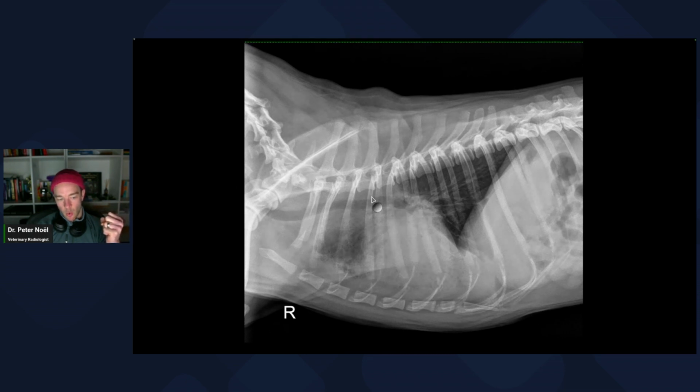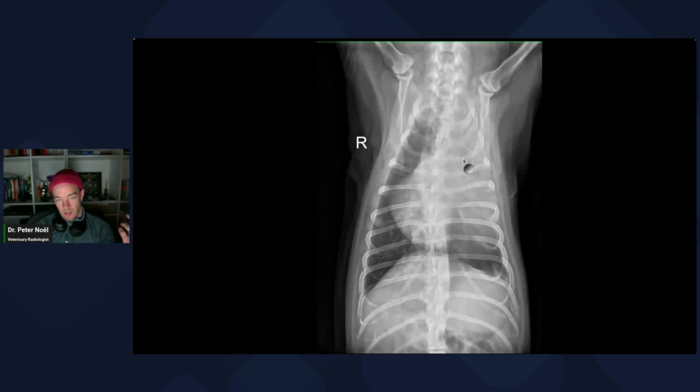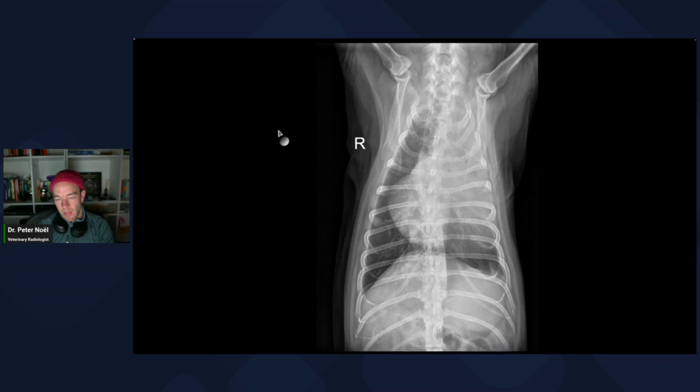You can't see it. Normally, you have the trachea coming down here, and you get this J hook, right? The J hook, you get the left cranial lobar bronchus, and then the caudal bronchus to the left cranial lung lobe gets this J hook. It's just gone. And then the other thing to consider is the lobe. So that left cranial lung lobe is game on for pugs, the poster child. We tend to think of right middle lung lobe for the Borzoi and Afghan hounds, maybe sight hounds tend to like the right middle lung lobe.